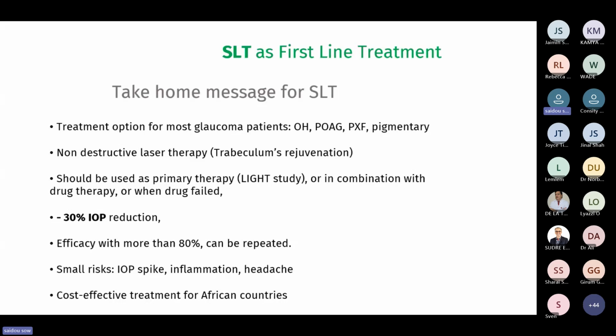What is interesting with this technique is that it can be repeated anytime. There are small risks, with an IOP spike just after the procedure and some inflammation that can be handled with anti-inflammatories. Sometimes patients can feel some headache, but it's a cost-effective treatment for African countries.